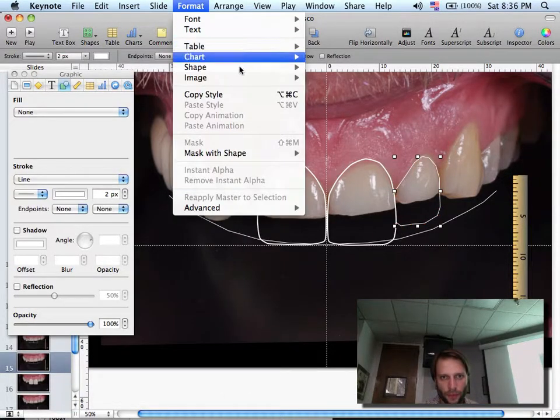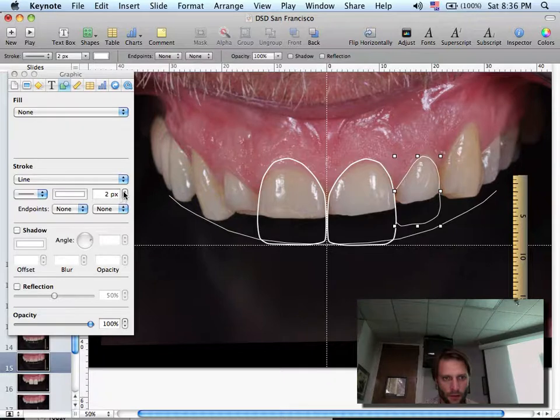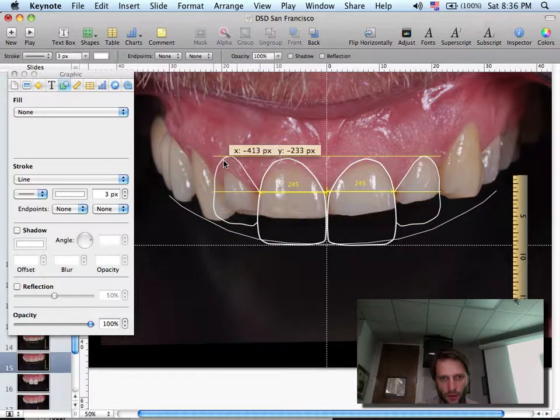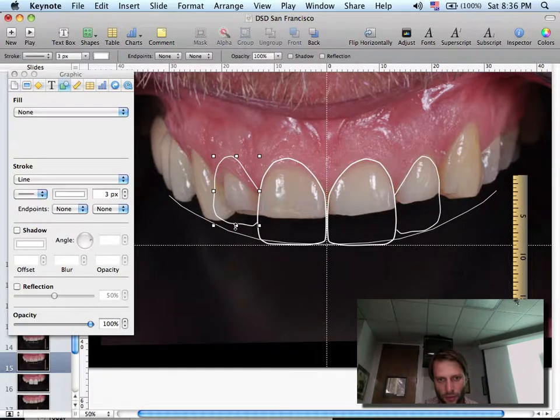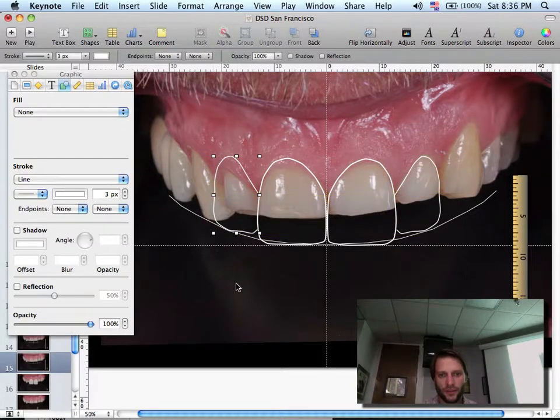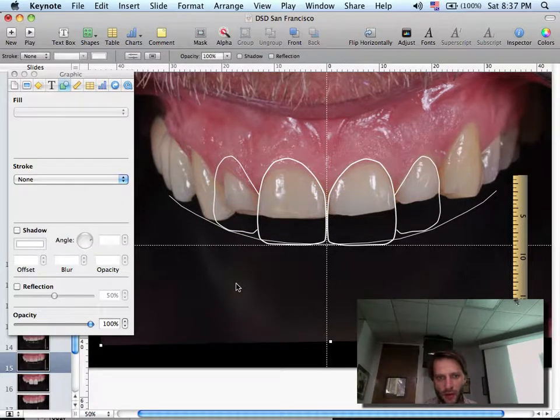Smooth, thicker, duplicate, flip, and position. This is the position. Now it's a little too short. Make it longer. Come to the other one, match the length. Both the same size. Looks better.